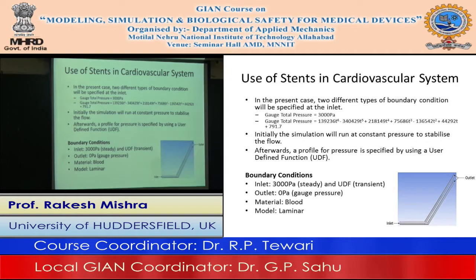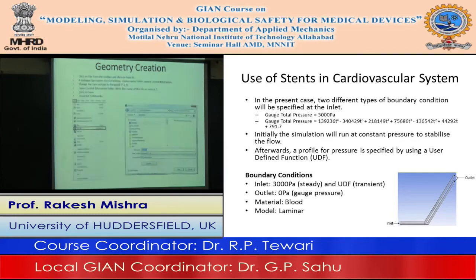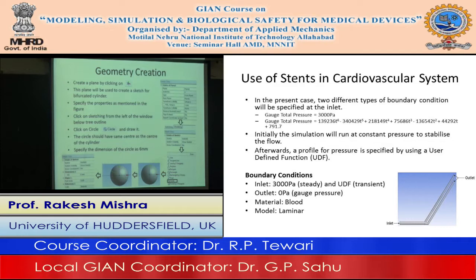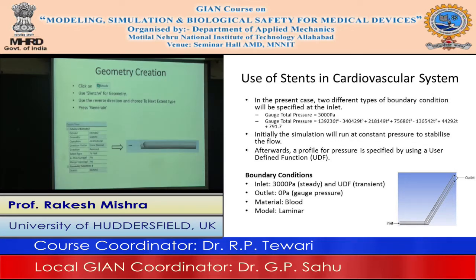So this is the step that we have done on the very first week, that first lecture we started. So this is exactly the same thing I am doing now here. So as I mentioned to you, this is the extrusion part. After extrusion, we create a plane, we create a hemisphere like last week. Hemisphere is created. Once this hemisphere is created, we create another plane and we join the hemisphere from this circle. So we have this extended part created here, like I just discussed.